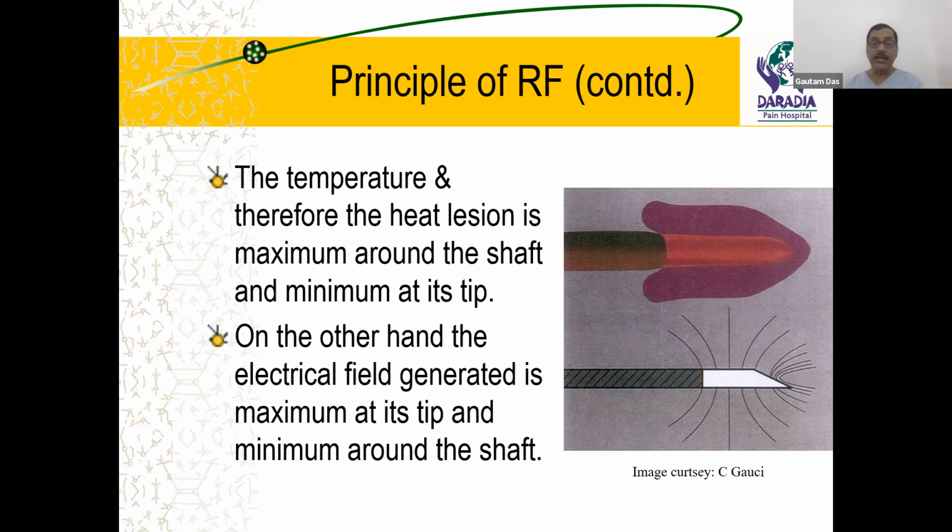How to put the needle? One is your thermal ablation, 80 degree, 65 to 90 degree. Another is no thermal ablation. It is because of the strong electromagnetic field. Now, if you are asking me the question, why strong electromagnetic field is going to have some analgesic effect? Again, it is still not clearly understood. But few hypotheses are there.